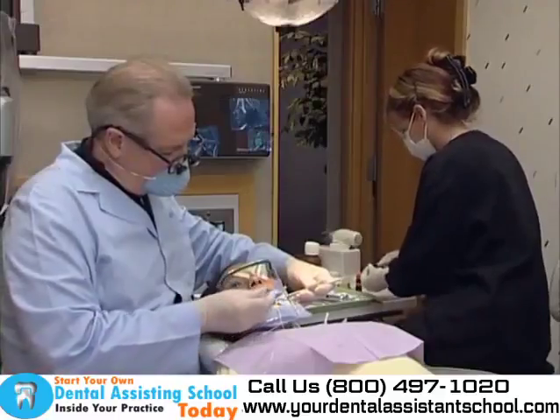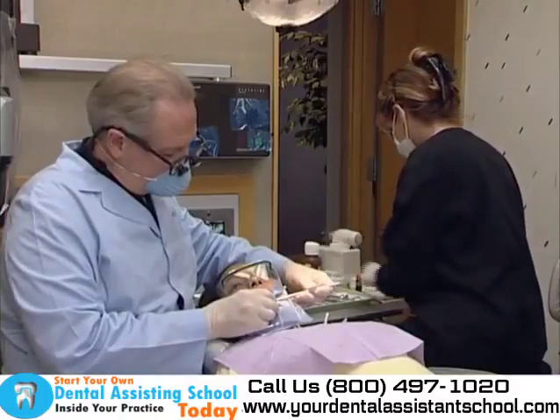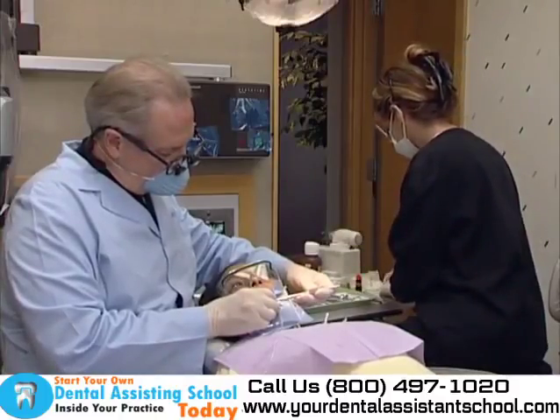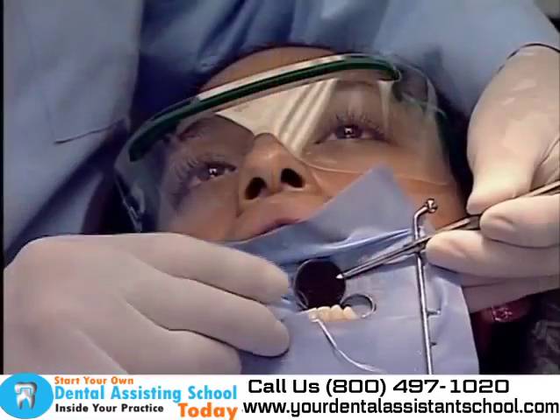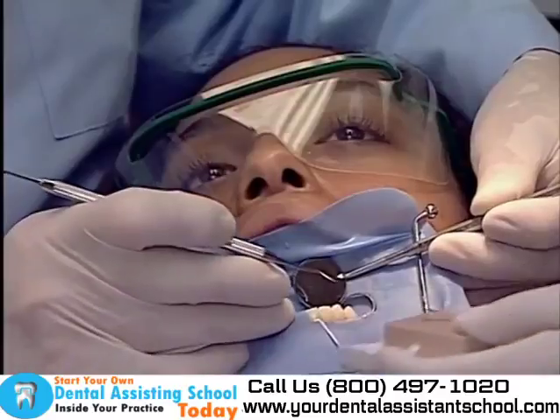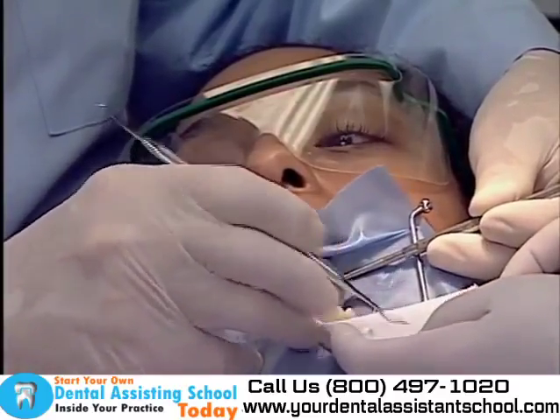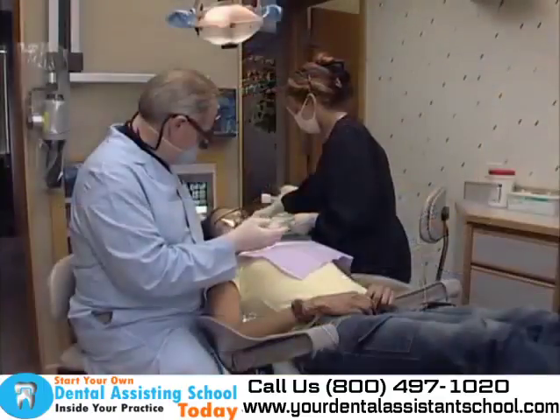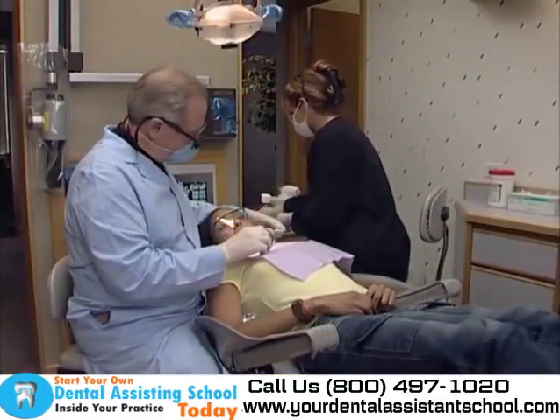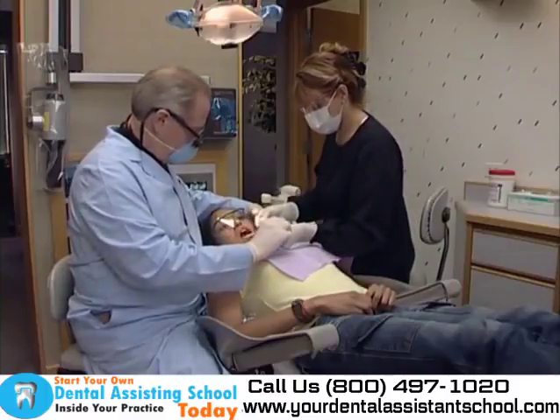Rubber dams also aid in infection control. They help prevent injury to the soft tissues of the patient's mouth while keeping the operating area dry. Rubber dams help the patient by reducing the length of the procedure and preventing him or her from swallowing or aspirating any materials. During the preparation of a rubber dam placement, the dental assistant needs to be familiar with the procedure and the instruments being used.